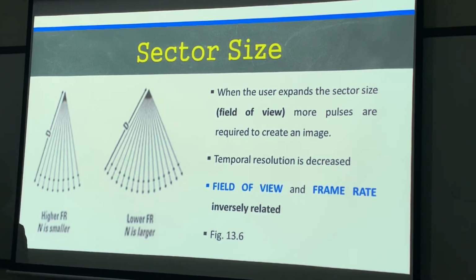Again, we can't see that because our eyes aren't able to detect that speed, because sound moves so fast. But this is the science of what's happening. With our eyes, wide scan and narrow sector width, it's still moving in real time to us. But in actuality, it's really not. It's moving slower when you have wide scan on compared to when you narrow the field of view.